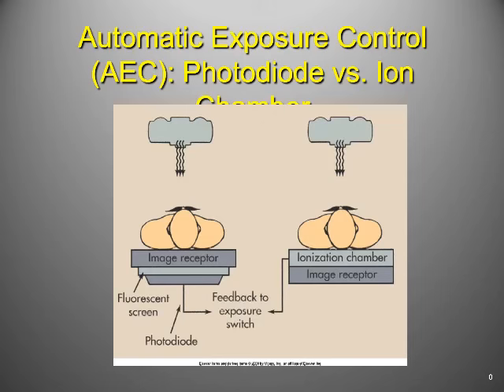AEC just sounds stupid. But they are AECs, and they have 2 basic patterns of use. One of them may be a photodiode one, and what that means is it's causing phosphorescence within a diode.